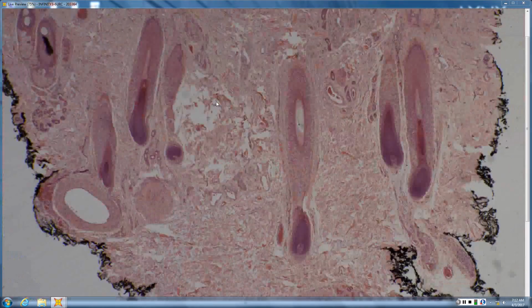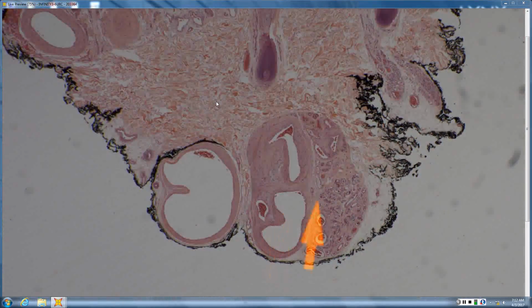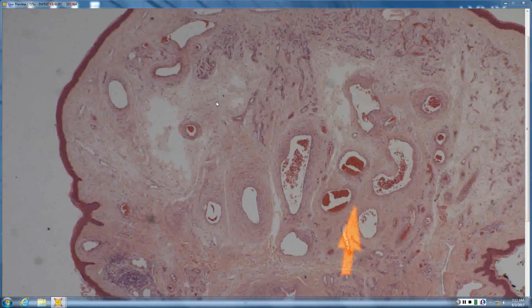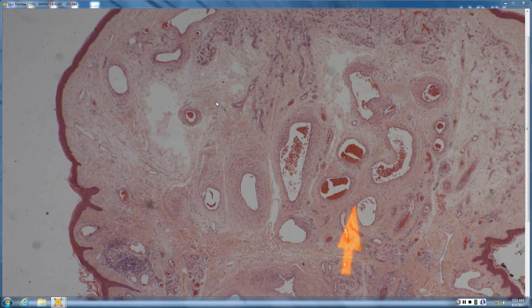There's even a deeper component here where you can see, again, that malformation between these thicker-walled vessels. They're not only large vessels, but they're thick-walled, and then all these tiny little capillary-sized vessels. So that's really what makes it a true AVM, and we don't always see them this well defined. Sometimes AVM can become sort of a diagnosis of exclusion when it doesn't fit anything else, and it's just an otherwise benign hemangioma, but it has some subtle changes in the vascular size. So that was more of a true AVM.